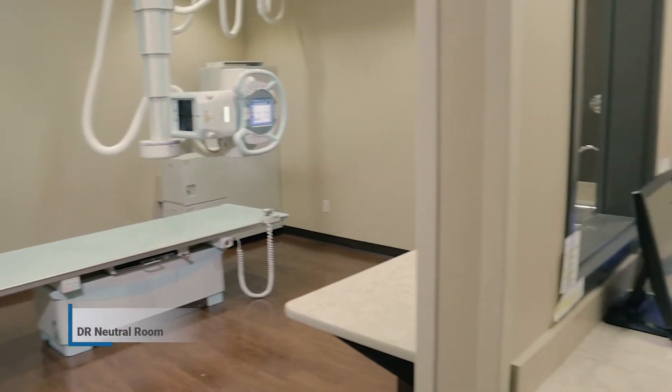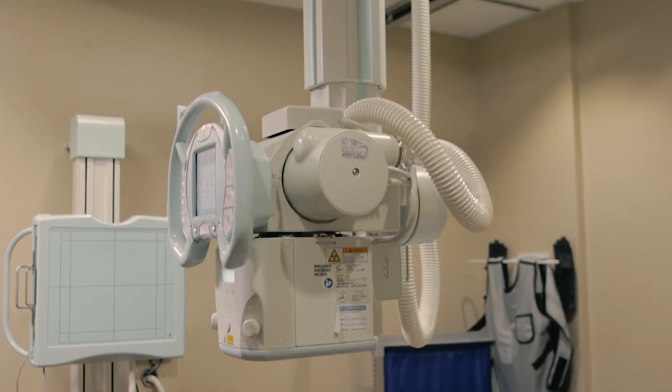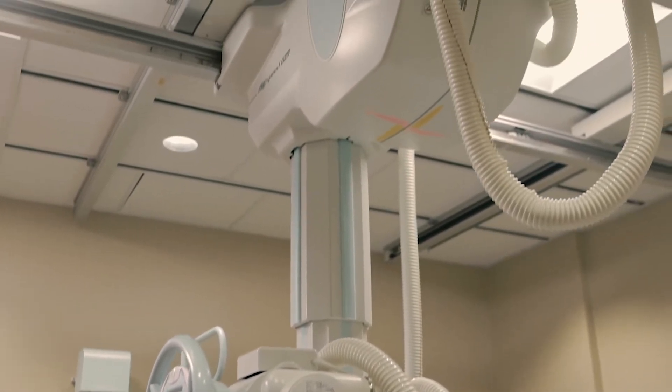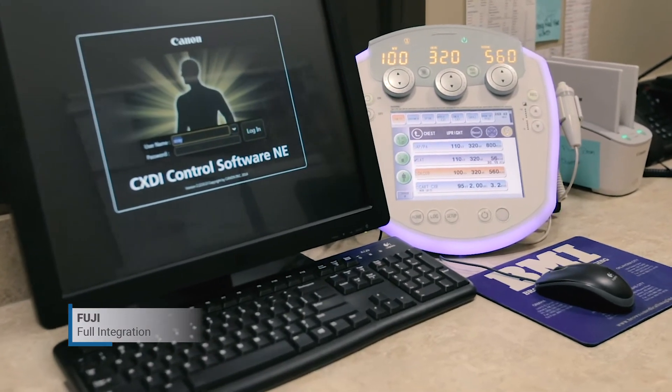The Shimadzu RadSpeed Pro X-Ray System is a DR-neutral room, meaning it can be fully integrated with a variety of DR manufacturers, such as Canon, Konica, or Fuji, based on customer preference.